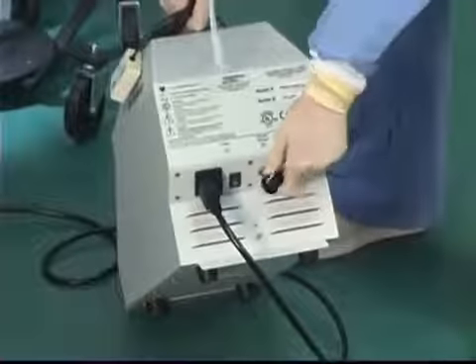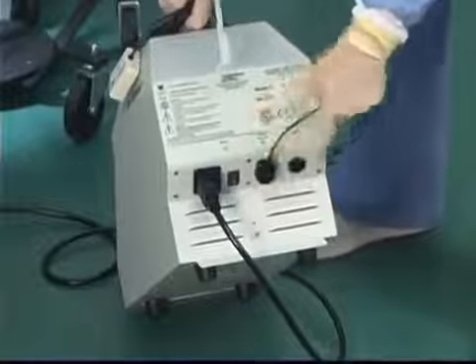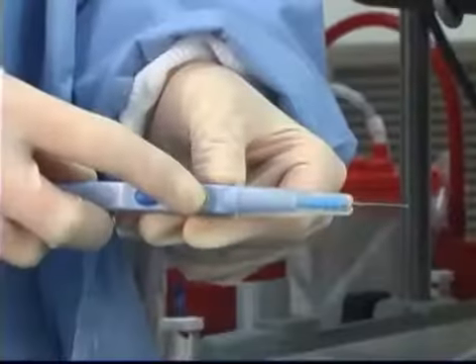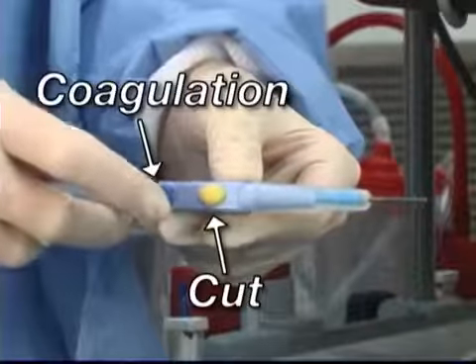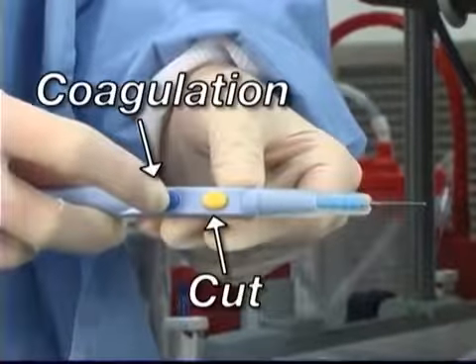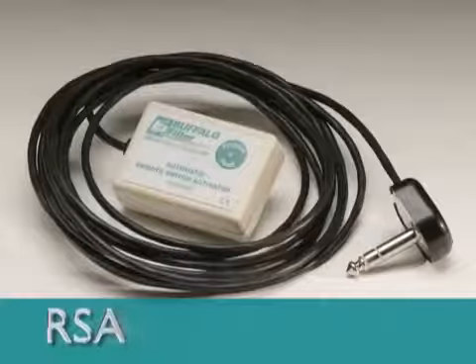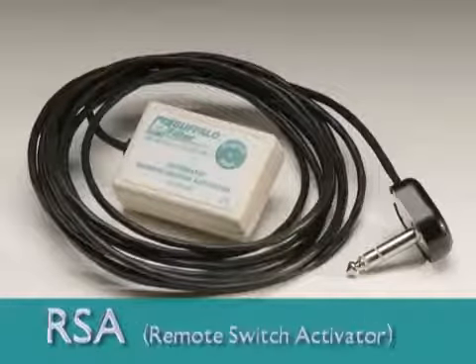As a convenience, a remote switch activator, or RSA, is available to initiate the smoke evacuation system automatically when either the cut or coagulation button is depressed on the electrosurgical pencil. A detailed description of the RSA and its functions is contained in the chapter of this program entitled Remote Switch Activator.